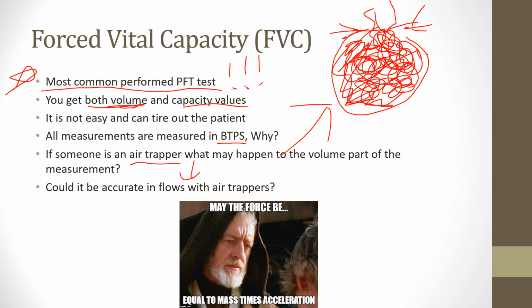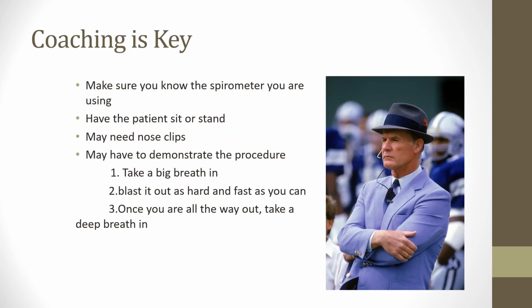this patient. Could it be accurate in flow rates for air trappers? So instead of looking at volume, let's look at flows. Could it be accurate in evaluating their expiratory flow rate? Well, absolutely. It will be accurate in looking at their expiratory flow rate. So that will be just fine. In fact, this test is forced, and to look at a flow rate, the test needs to be forced. Right, so when you're looking at this, yes, it will be accurate for those obstructive patients.